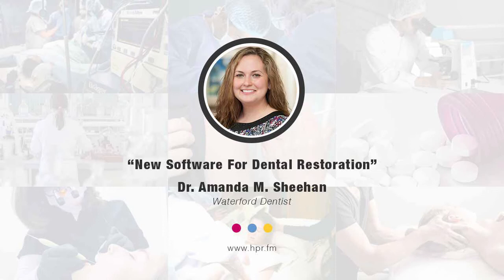And so that really is one of the greatest advancements, especially for the permanent smile, but for temporaries too, because we can print off the temporaries and they just look far more natural because we're not sitting there carving them. It's already printed out. We've already decided exactly the shape that we want based off the patient's smile and how their face looks. So we design the optimum shape and design for them.